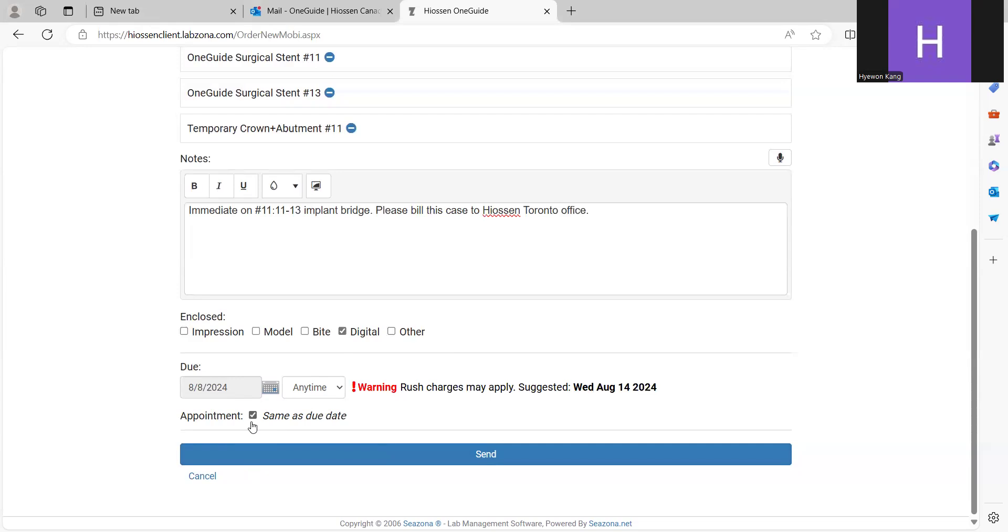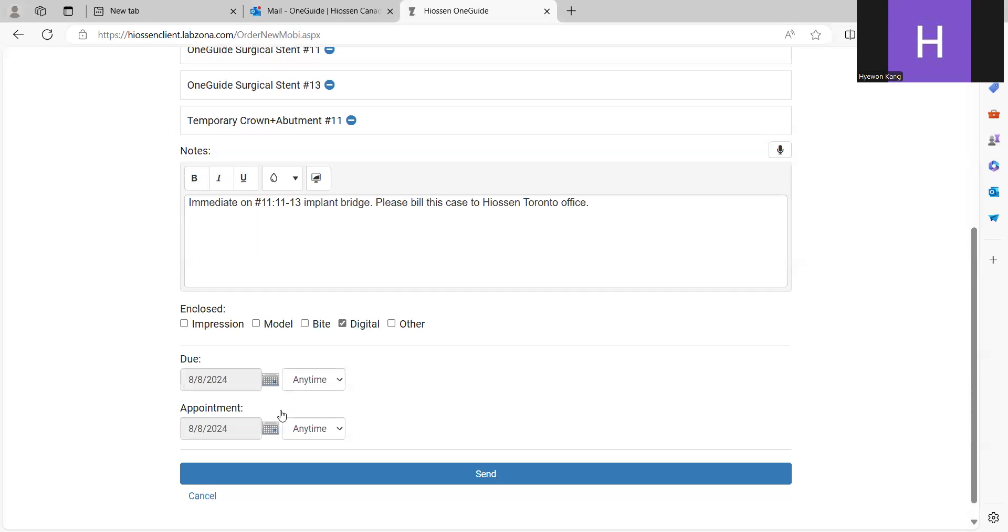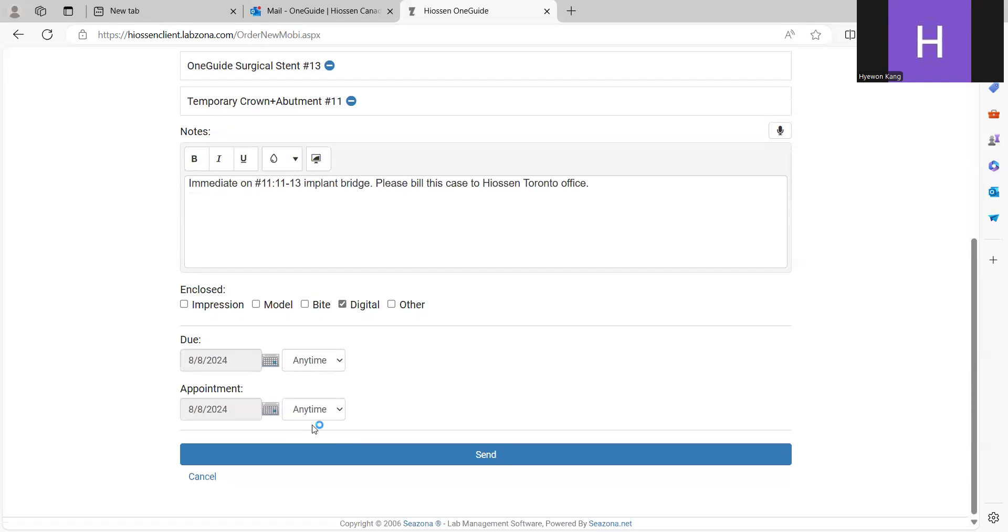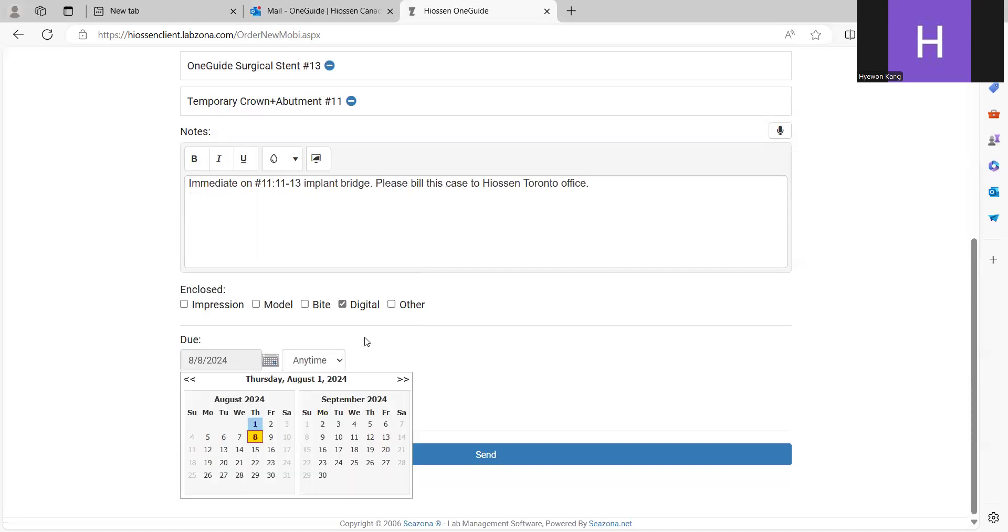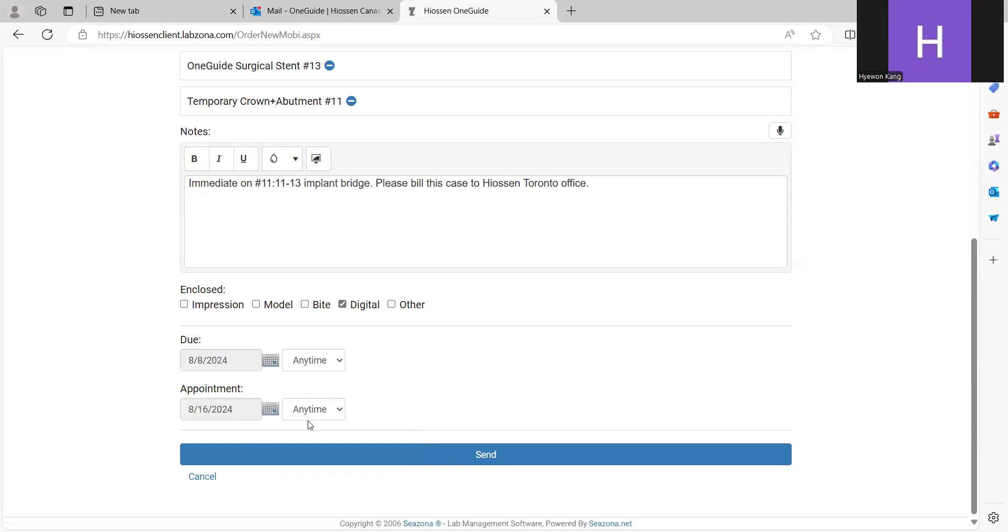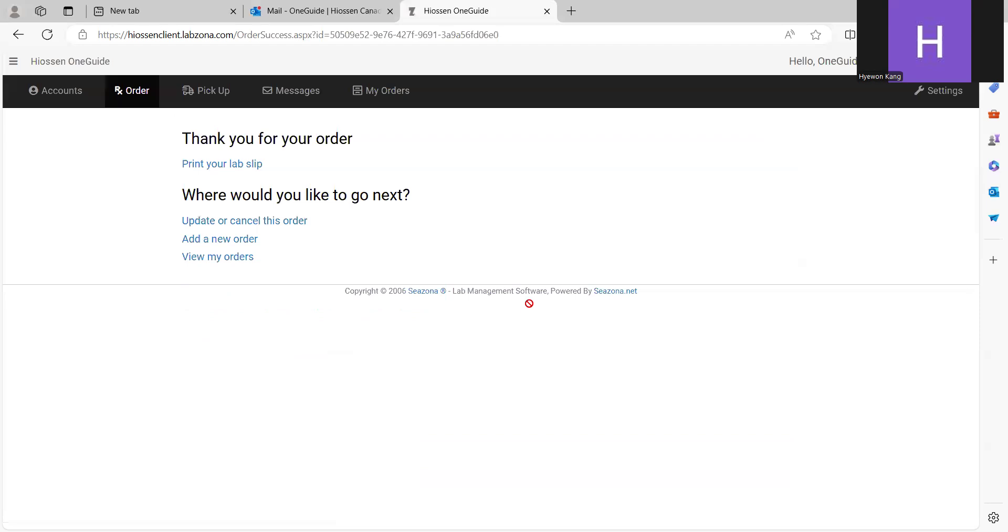If you uncheck the appointment checkbox here, you can enter the schedule, surgery date and time here. If patient booked for 16, 3 p.m. And send.